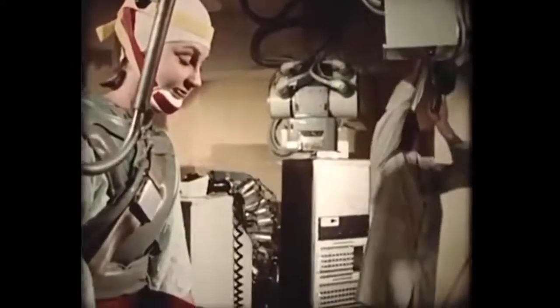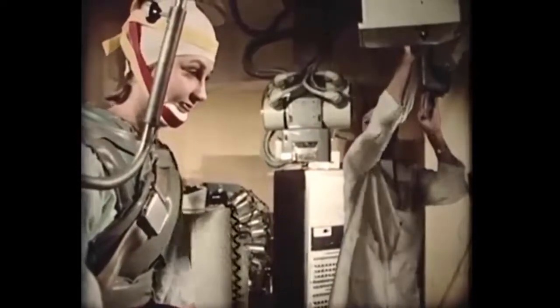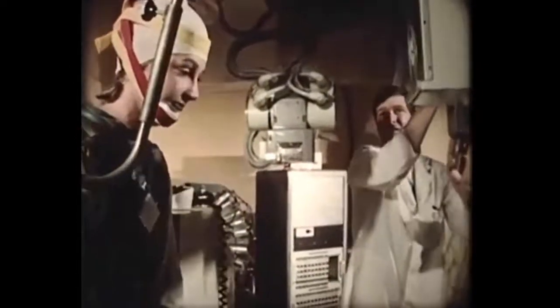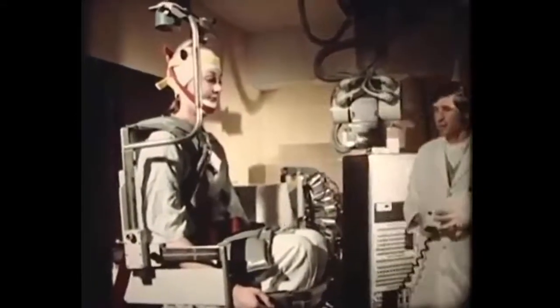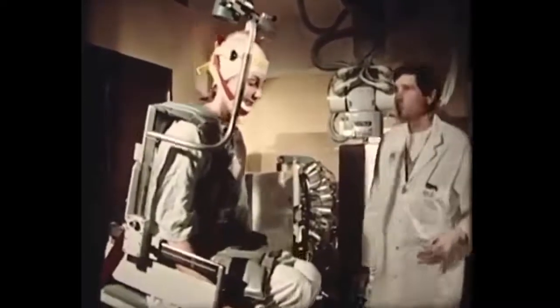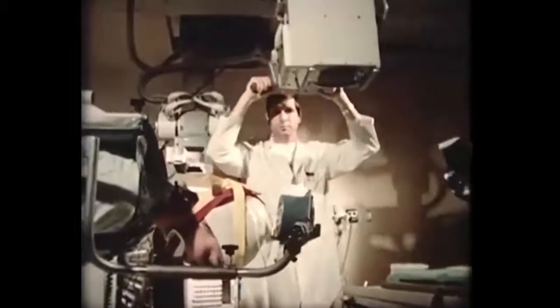A pneumoencephalogram, which is an air study that people talk about, we used to do 2 or 3 of those a day. A lumbar puncture, where a needle is put into the spinal canal, and air is injected, and essentially let it bubble up into the head. And then the patient is put in all kinds of funny positions. Now that's the study that is at the very top of my list of studies that I wouldn't want done to myself. Now with CT, we're doing one of those a week.